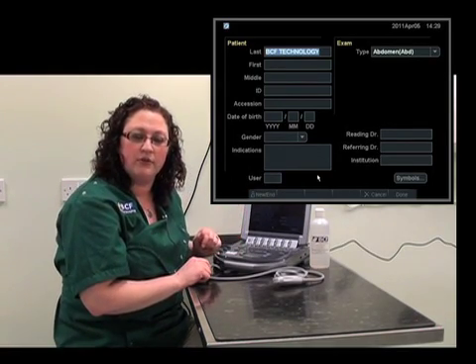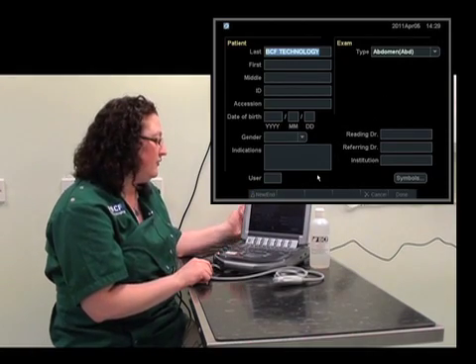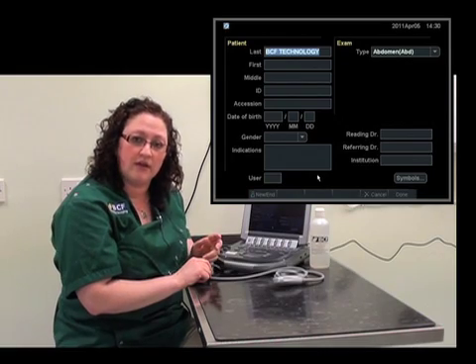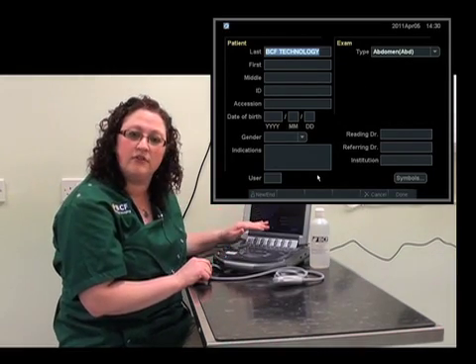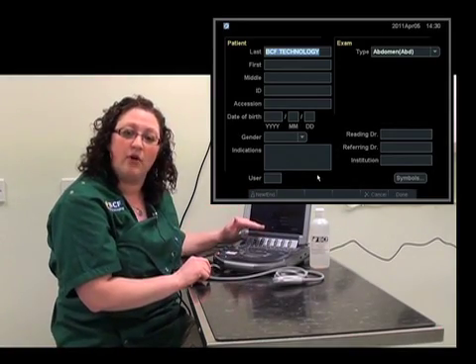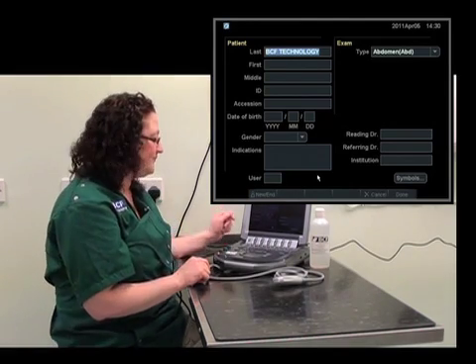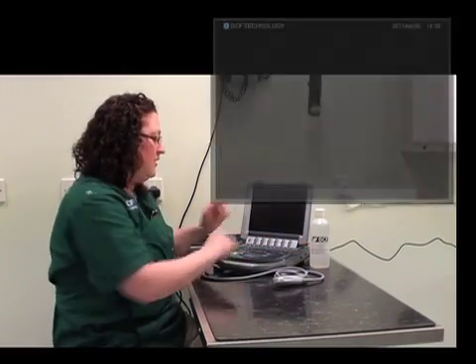Another thing you can do while accessing the patient record is to specify what type of exam you're going to be performing, whether that's a cardiac exam or in this case an abdominal exam. This will help the machine to set up presets for the monitor and certain buttons throughout the exam, just to make it a little easier for you. We've set this up and we're ready to get started.